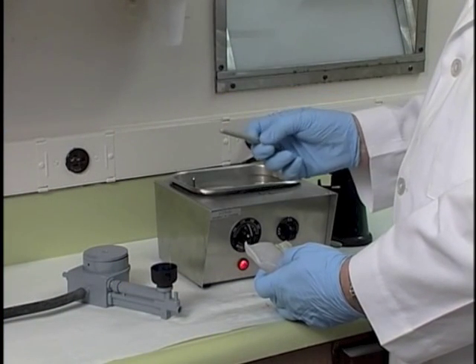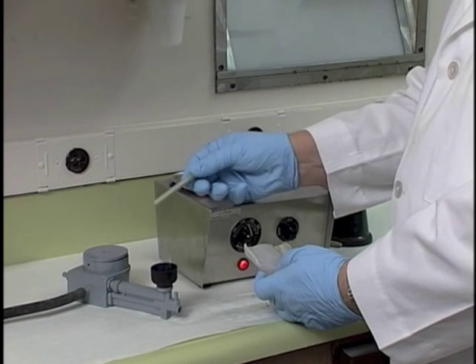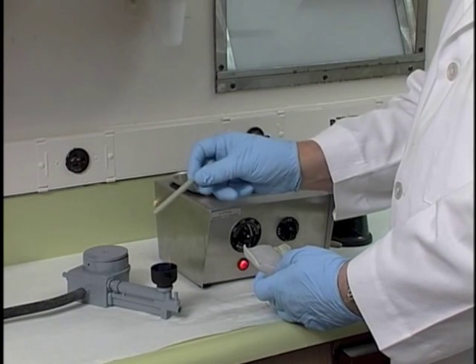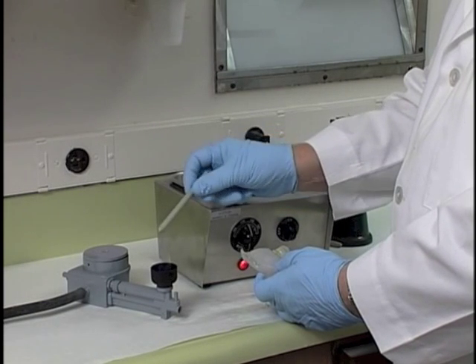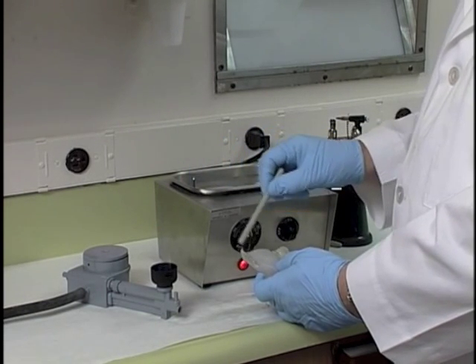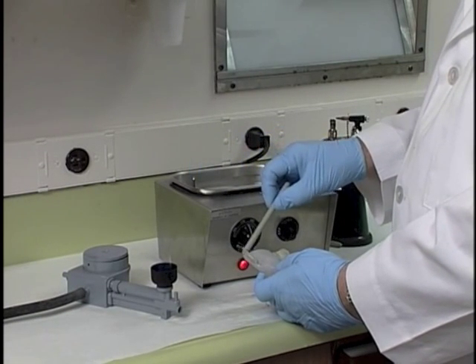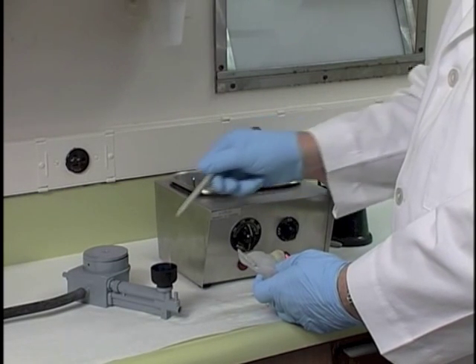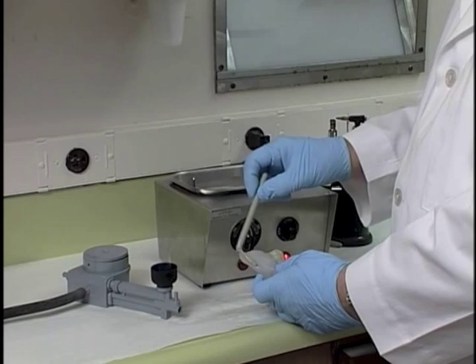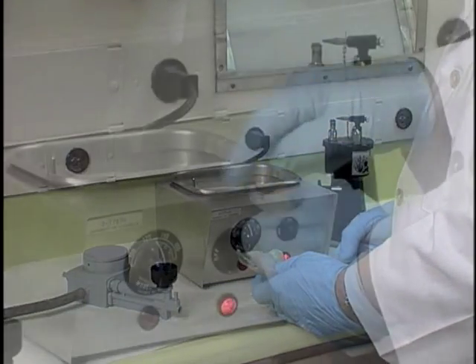Another way of softening the compound in order to apply it to an area is to heat the tip of the compound directly in the flame and then smear the compound onto the edge of the tray. Some operators like this better than trying to heat the entire end of a stick of compound. I think that's personal choice, frankly. I do it both ways. I don't think it makes an awful lot of difference to me.